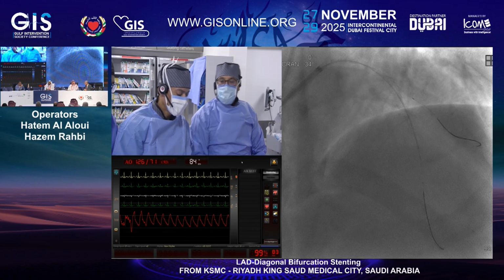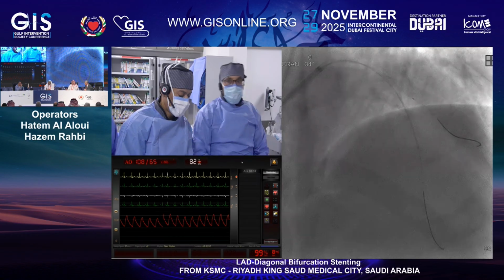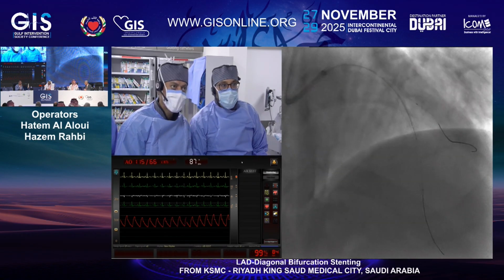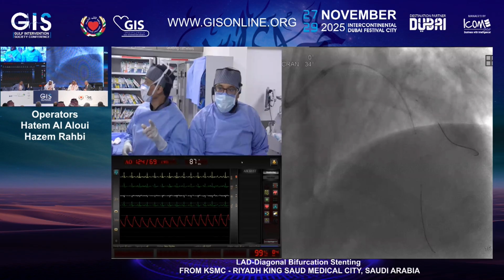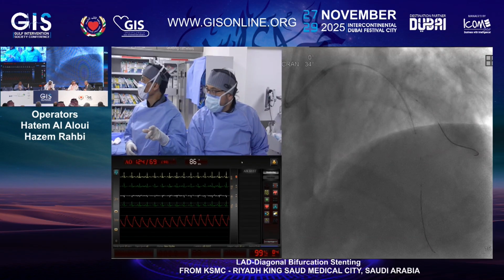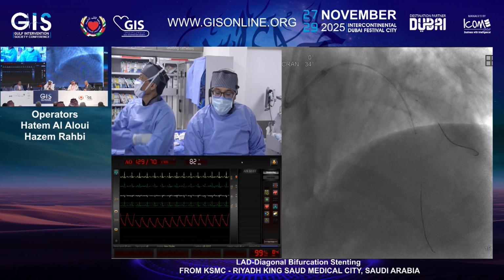The only time I will not do imaging is if there is a financial obstacle. But if there is calcification or difficulty, I will definitely do imaging. Even if there is a financial obstacle, I will do imaging for the proximal and distal edge. Do you do IVUS with calcification? Yes, 100%.